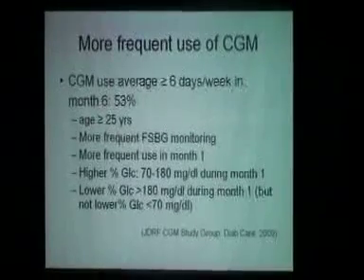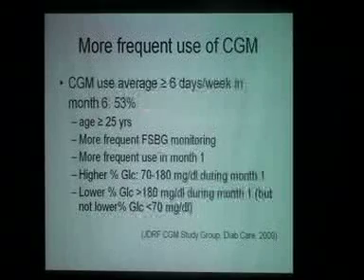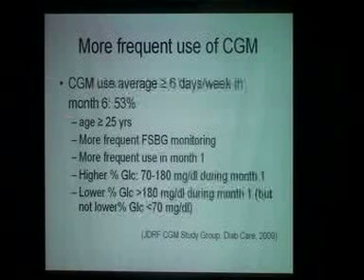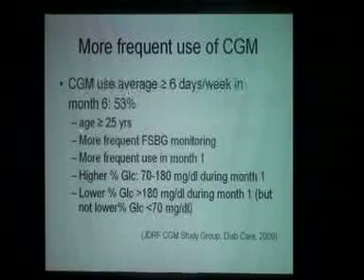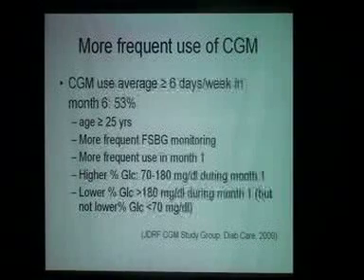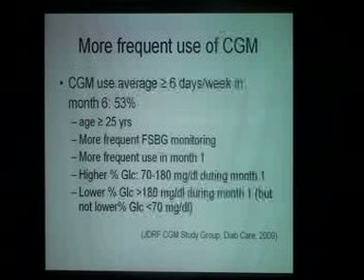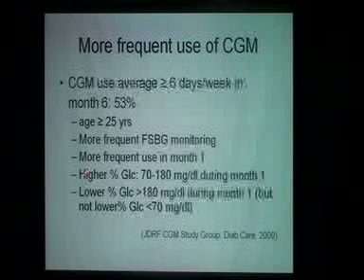Now, they had divided the patients into 3 subgroups, based on the age. Age more than 25, between 14 and 25, and between 8 and 14. So adults had the best adherence, and age more than 25 was a factor that they stayed with more than 6 days use the best. The worst group, what would you expect to be among these 3 groups? Yeah, 14 to 25 had the least adherence.